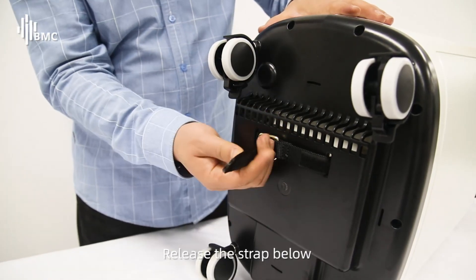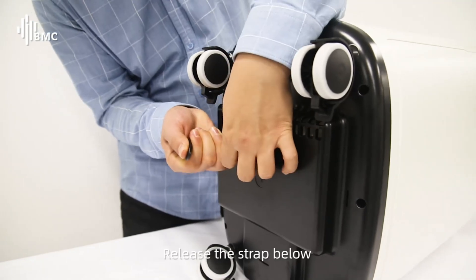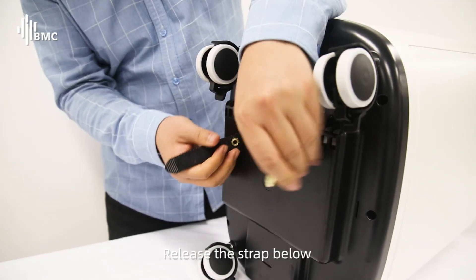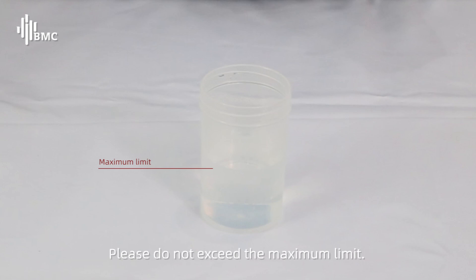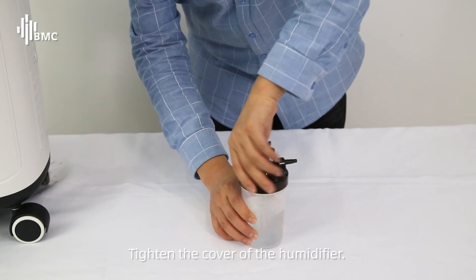Release the strap below. Add an appropriate amount of water into the humidifier. Please do not exceed the maximum limit. Tighten the cover of the humidifier.